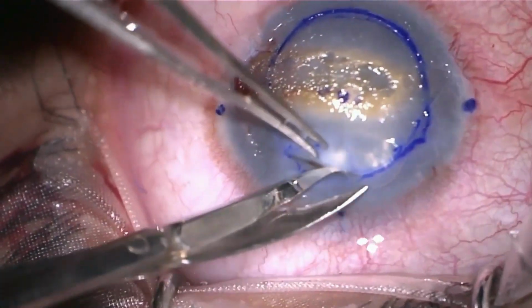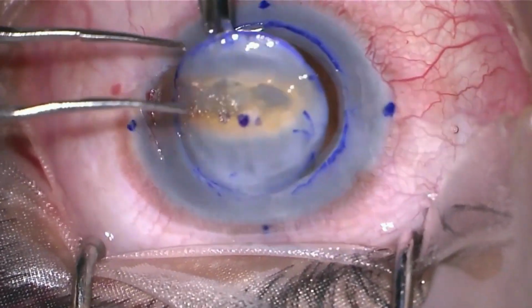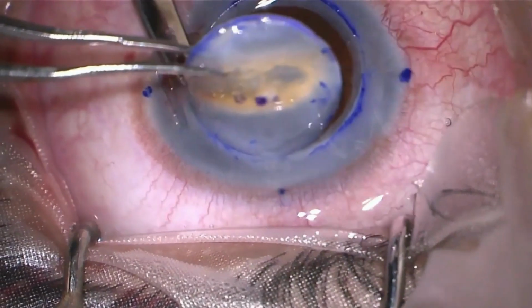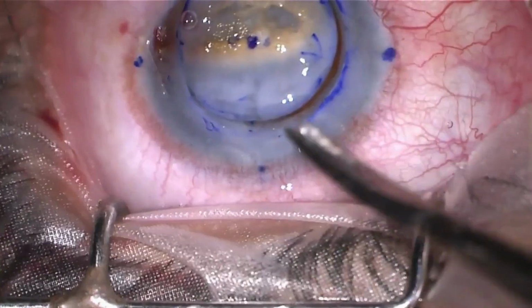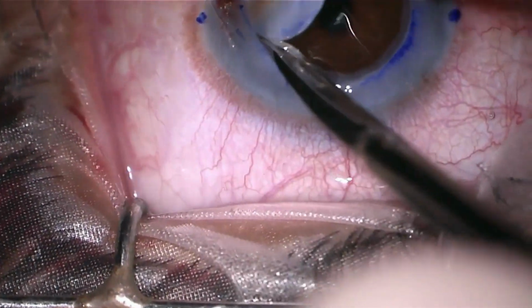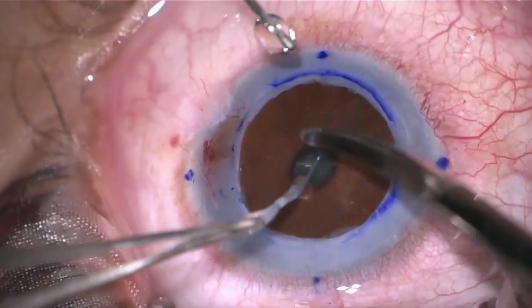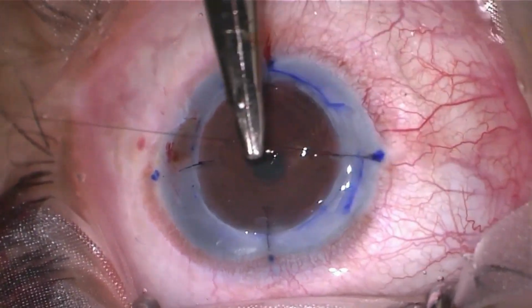The host button was cut circumferentially with Vannas scissors, followed by placement of the donor tissue and securing the graft with interrupted 10-0 monofilament sutures.